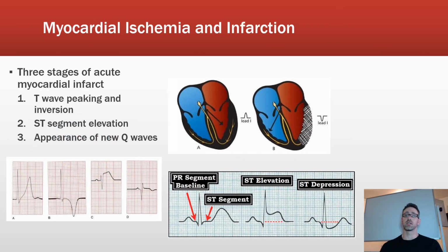This next section is about myocardial ischemia and infarctions, and what we would normally or characteristically see on an ECG. What kind of findings are there? This is one of the things that we need to be versed in, especially since patients presenting with chest pain all get an ECG. And so we need to be able to understand and interpret quickly what the ECG is showing us.